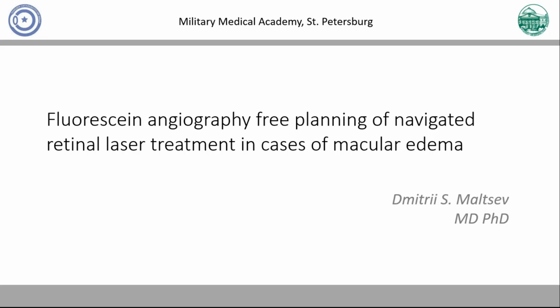In the next approximately 30 minutes, we will give you an overview on how to use the multimodal planning capabilities of the Navilas laser system with a special focus on replacing fluorescein angiography for the treatment of DME and CSCR. I'm very happy to welcome today's presenter, Dr. Dmitrii Maltsev from the Ophthalmology Department at the Military Medical Academy in St. Petersburg.